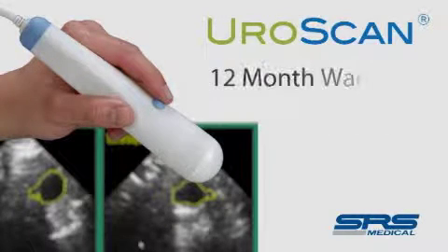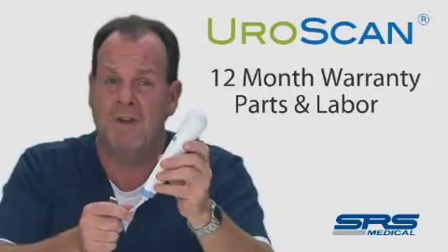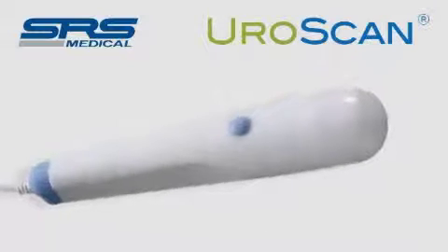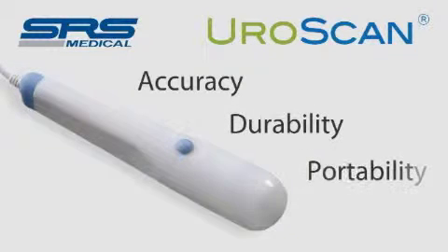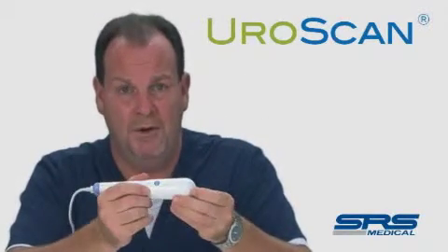The UroScan is backed by a 12-month parts and labor warranty provided by SRS Medical, and they even provide loaners should your device need service at any point in time. There is no device in this product category that provides the level of accuracy, durability, and portability as the UroScan does, at a price that's less than $10,000. It's truly a great value for ultrasound of the bladder.